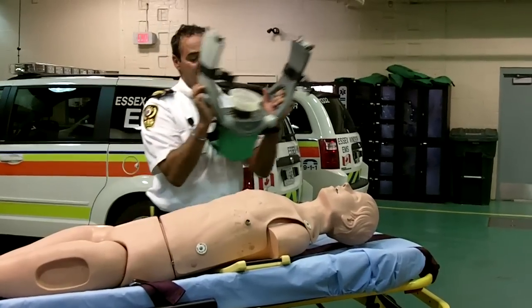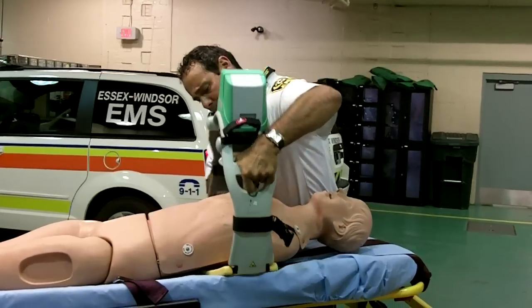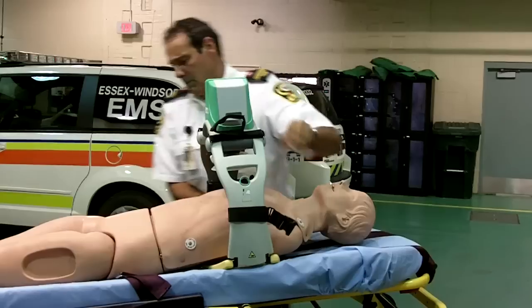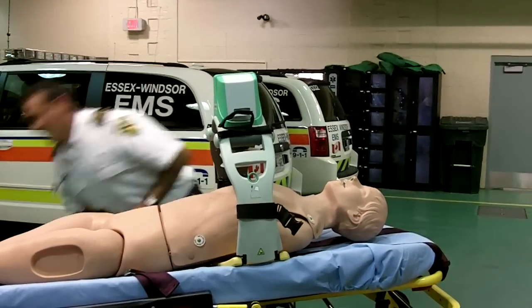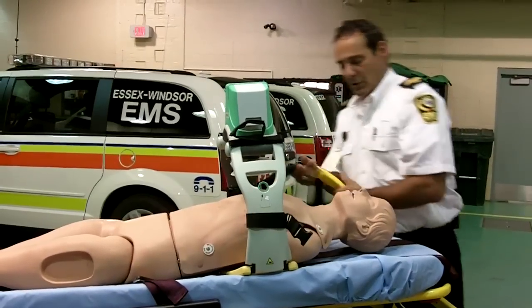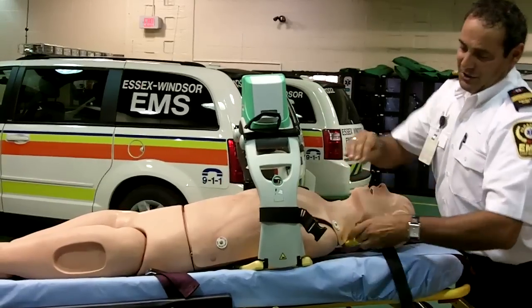We have our plunger set that just goes right over the top and snaps on. We have another strap that goes around and holds the whole Lucas II in place.